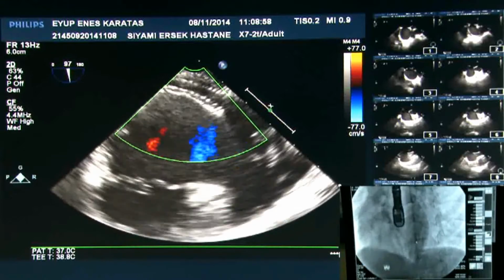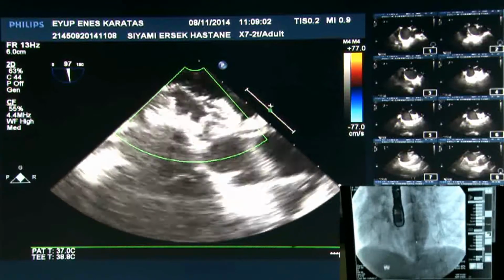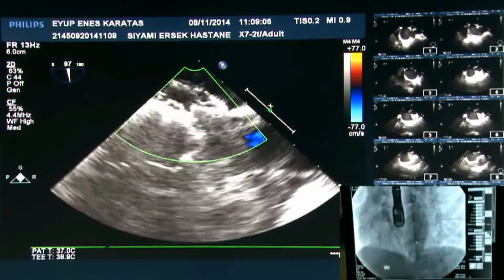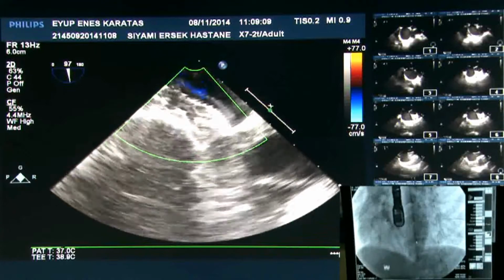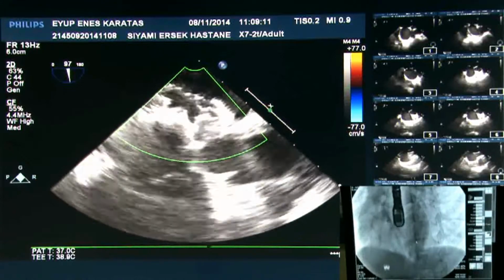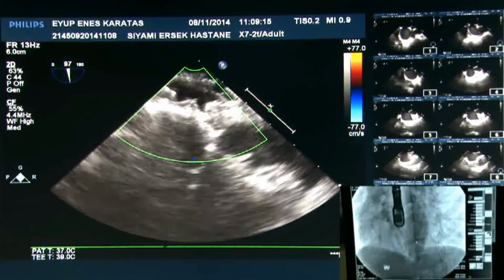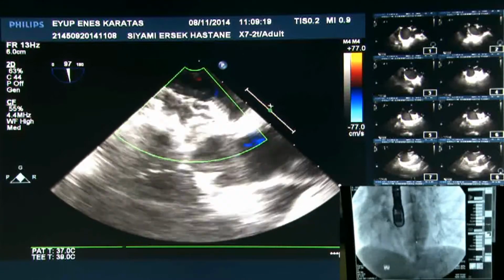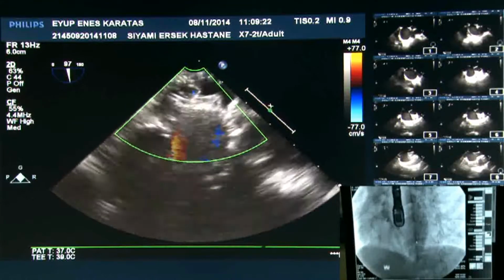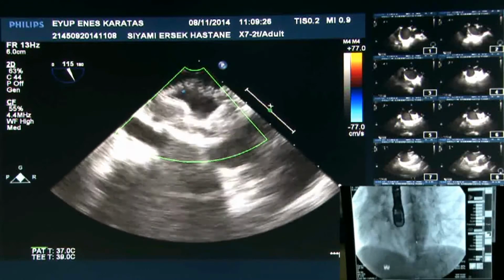13. Okay, 1 millimeter. But you see the appearance of the left atrial disc, which is bulky. It may be bulky because it's an Occlutech, but it may also be bulky because it's 1 or 2 millimeter larger than it should be or than is necessary. So that is something with regard to echo measurements. I'm more than a powerful supporter of balloon sizing, even though Jacques is not recommending it.